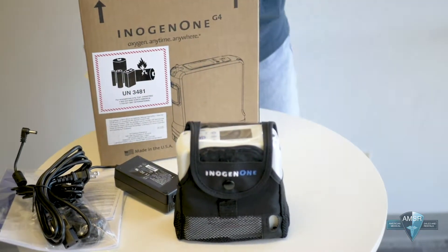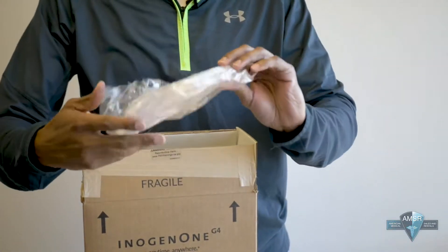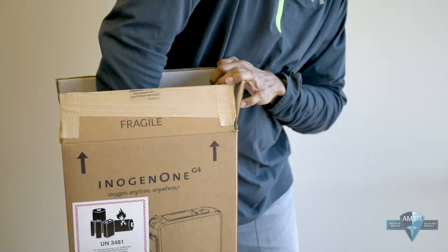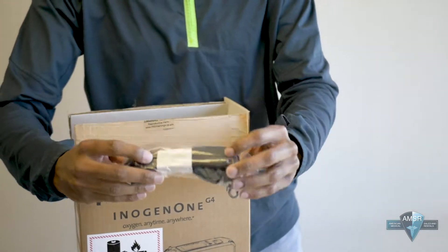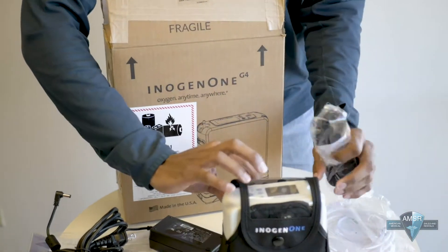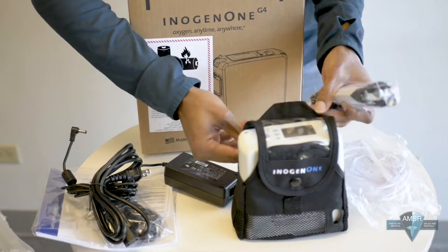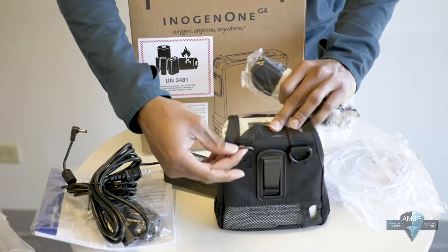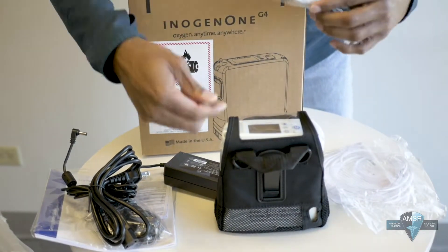So you've got both of your adapters and your manual, and we also provide you with a seven-foot cannula. This is the shoulder strap to the unit — it's folded up right now but it connects to the back portion of the unit so you can carry it over your shoulder.